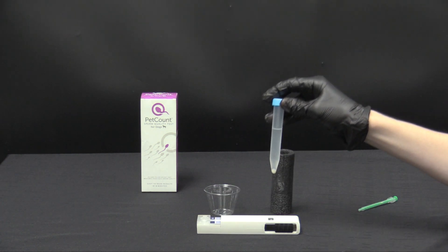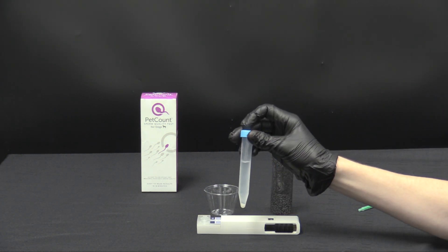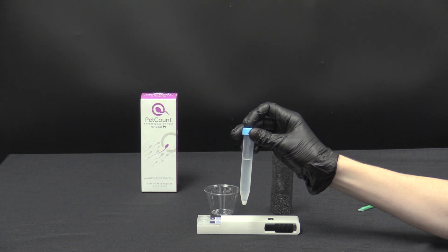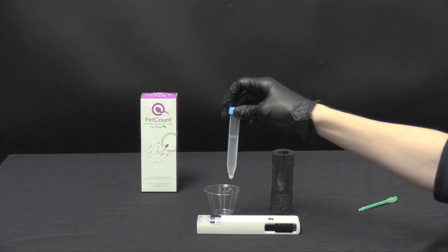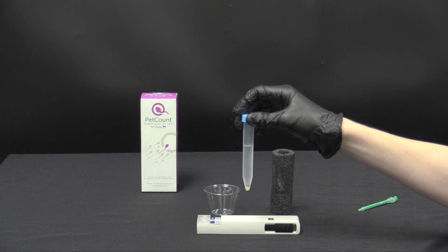Okay so next we'll take our sperm sample. Notice in this sample we have some settling due to density differences in the bottom of this tube. So prior to testing make sure your sperm sample is well mixed either in the tube or in the cup provided.